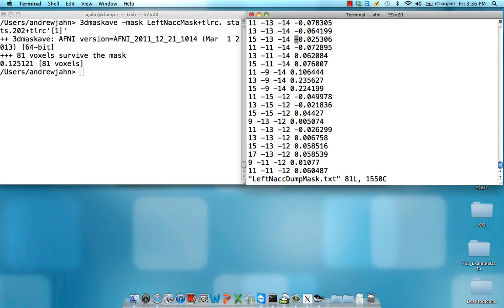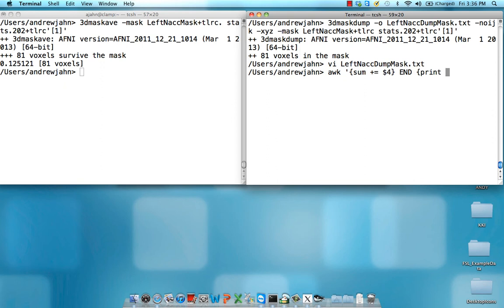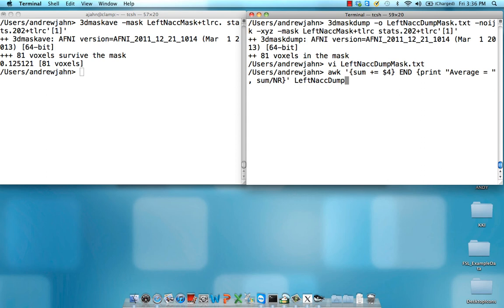So in this text file output from 3d mask dump, I get a single beta weight for each voxel. Now to actually take the average across all of those voxels within that region of interest, I can use either Excel or from the command line something like AWK. This is just an example that I use. If you have something else that you'd like to use, feel free to do that. But here I'm just going to print out the average.